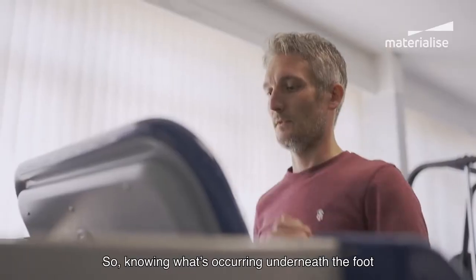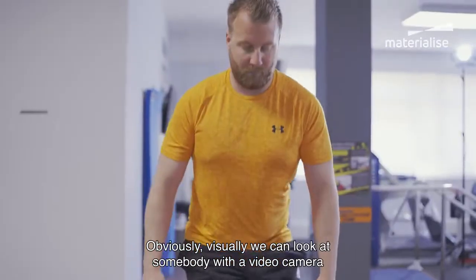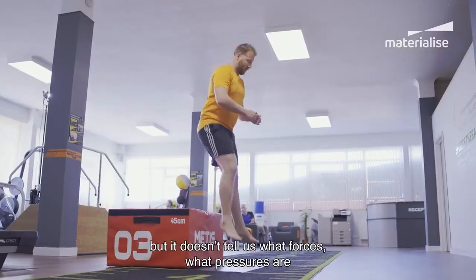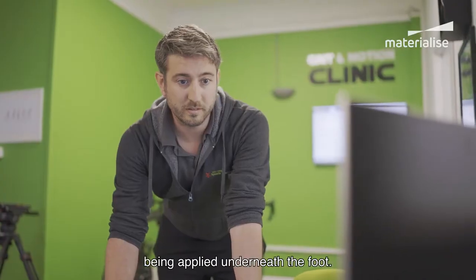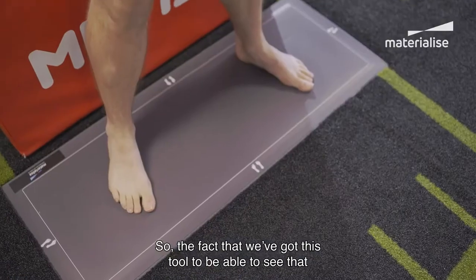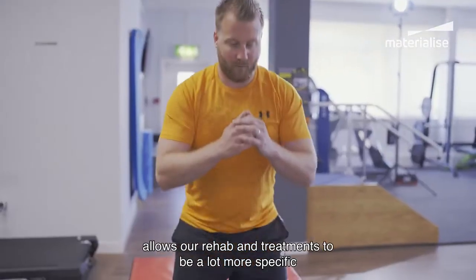Knowing what's occurring underneath the foot is really important. Visually we can look at somebody with a video camera and that tells us what the posture is doing, but it doesn't tell us what forces or pressures are being applied underneath the foot. Having this tool allows our rehab and treatments to be a lot more specific to that person.